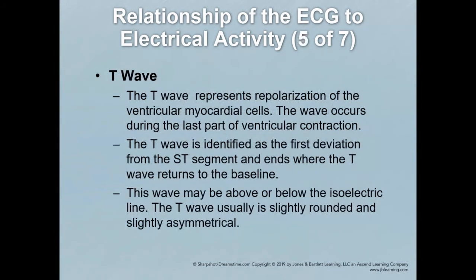And the T wave's the last part of our standard EKG, and it represents the repolarization of the ventricles, okay? It's typically a little bigger than the P wave. Sometimes it might be a little pointed, but usually not much. Most of the time it's going to be rounding up right, a lot like a P wave, just larger. So remember that the P wave is the atria depolarizing or firing.